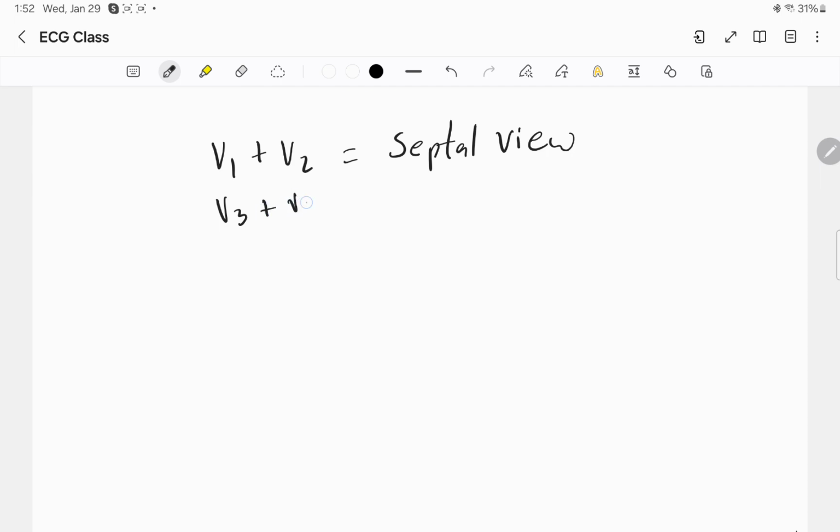V3 plus V4: anterior. Damn, it's spelled differently, my bad. But anyway, anterior.